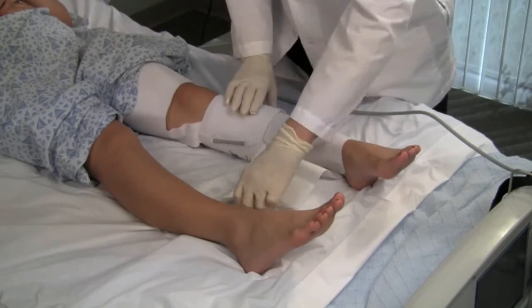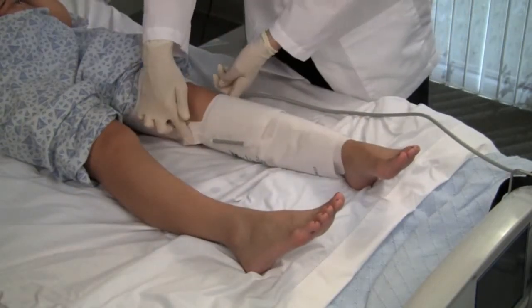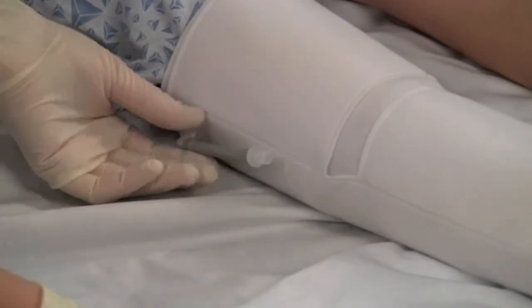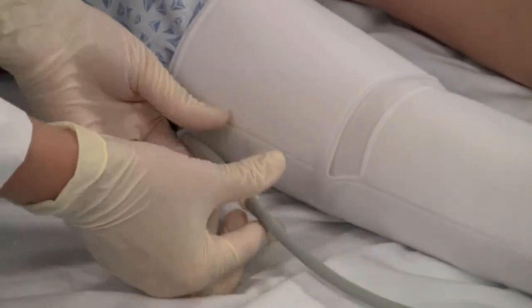For the thigh garment, the inflatable bladder should be directly behind the patient's calf with the cutout behind the knee. The outlet tube on the garment should not be in direct contact with the patient's skin. The tube should be connected to the tube set in the same manner as the other garments.